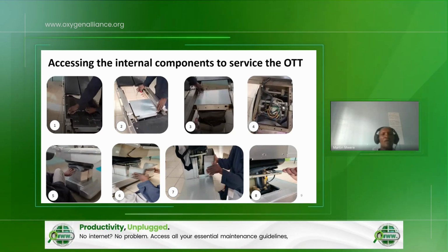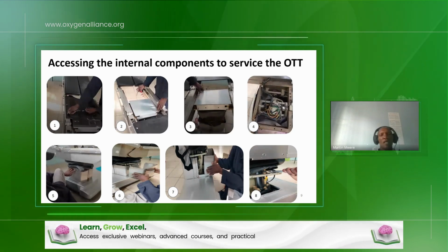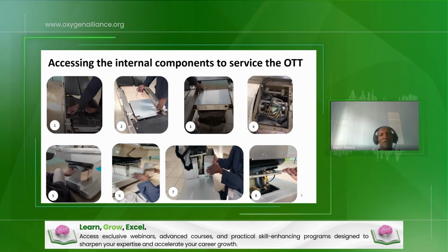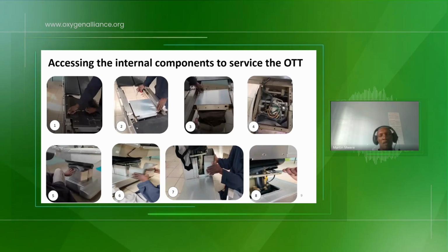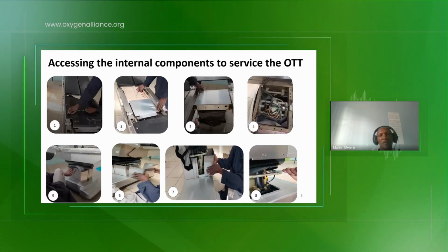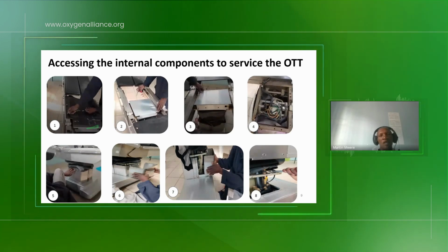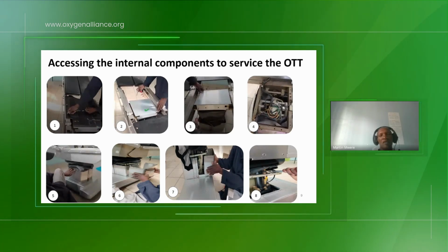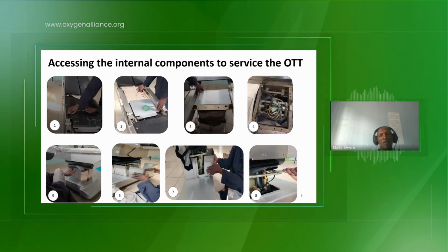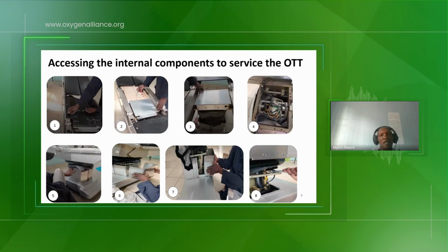If you would want to service the chair, you can see here, maybe it's not quite clear, but here we are able to see the inside part. We are removing the top covers. After you have removed the top covers, you need to disinfect these areas. Even here, you will find it is very dusty.